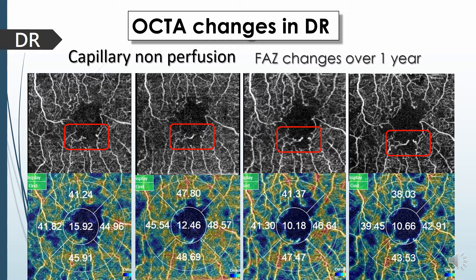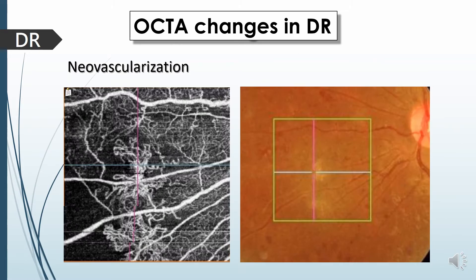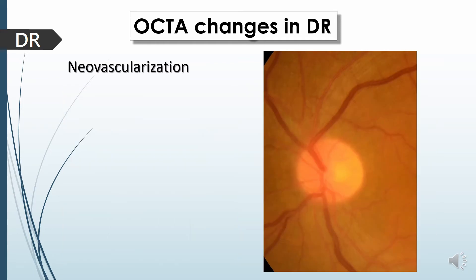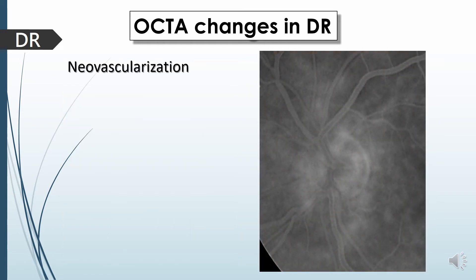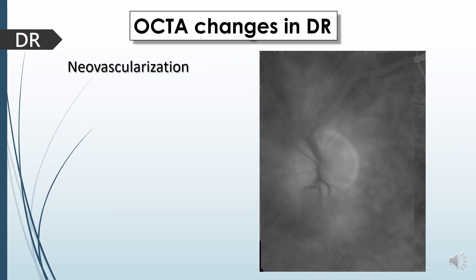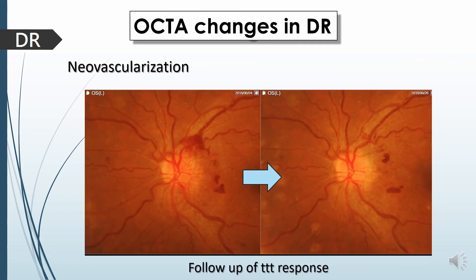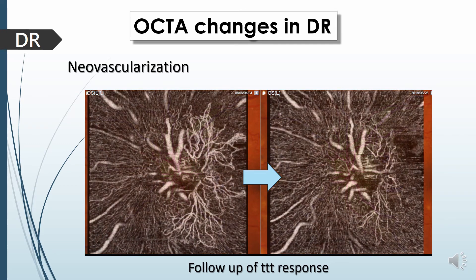OCT-A can also well delineate rising neovascular tufts in NVEs better than FFA, where leakage masks those lesions. Sometimes color and fluorescein angiogram are equivocal and not conclusive about the source of leakage; however, OCT angiography clearly delineates the hanging neovascular tuft from the edge of the disc. We can safely repeat OCT-A scans to follow up PDR patients and detect treatment response and regression of neovascularizations after injection of anti-VEGF or after pan-retinal photocoagulation.